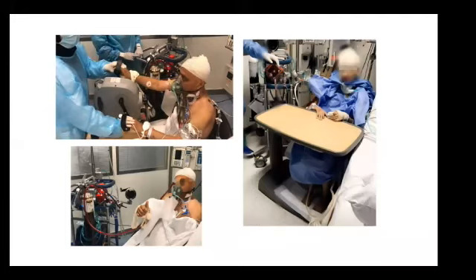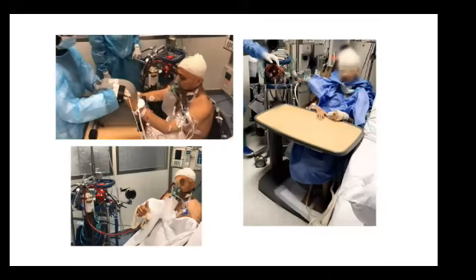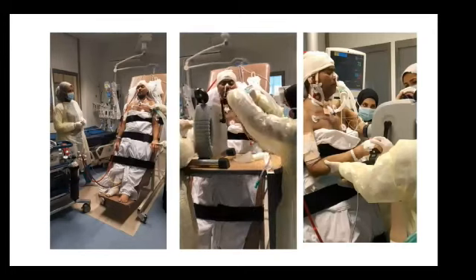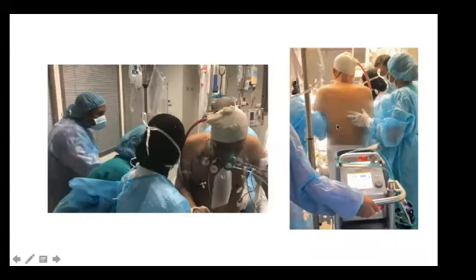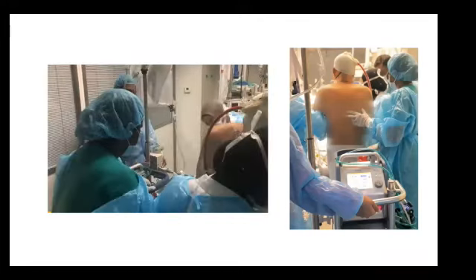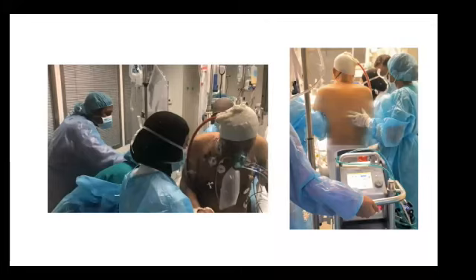Here we can put the patient on a chair. We can also continue doing exercise on the chair. We can start sit to stand exercise again in the chair position. Here, as I said, the tilting table. Walking with ECMO also, it's not easy, but it is achievable. We can make them walk. We can make the ECMO machine portable, by gathering all the team and assigning the responsibilities. And we also have to imagine how the patient will walk, so we can adjust the lines according to the walking path.